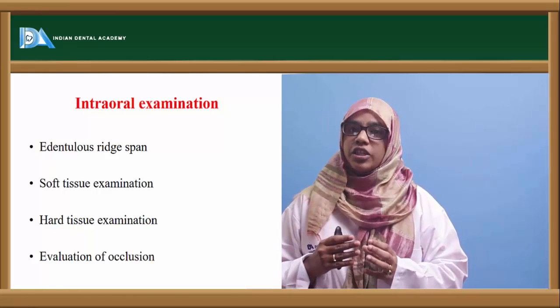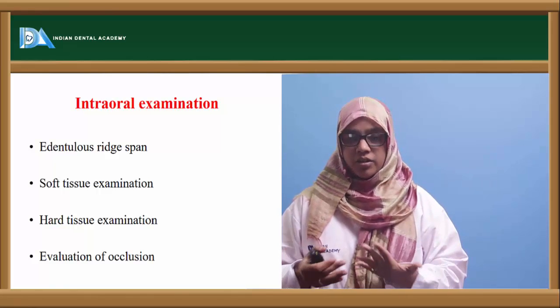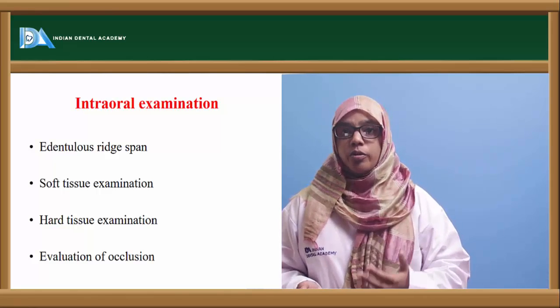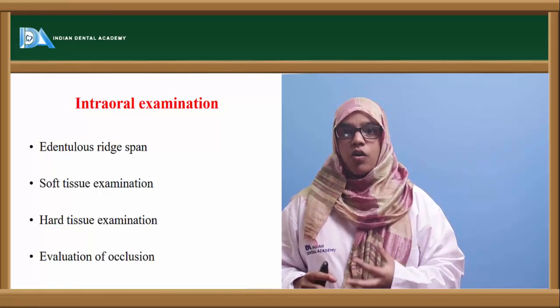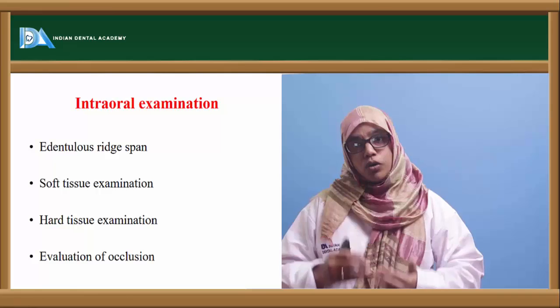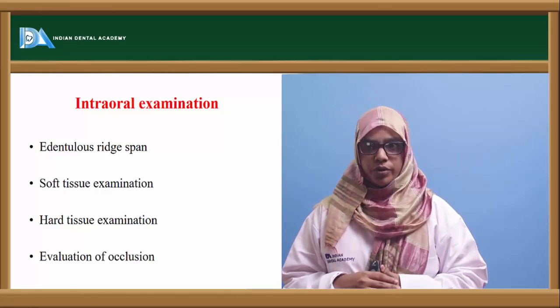When you are checking the edentulous span, check how stable the adjacent teeth are and whether they need restoration or not. Check the overlying soft tissue, and check for any bone prominence. If the overlying soft tissue is very fibrotic or fragile, or if there are any bony spicules, you have to remove them and do an alveoloplasty. You can also do an alveoloplasty at the time of implant placement. You need not do it beforehand.